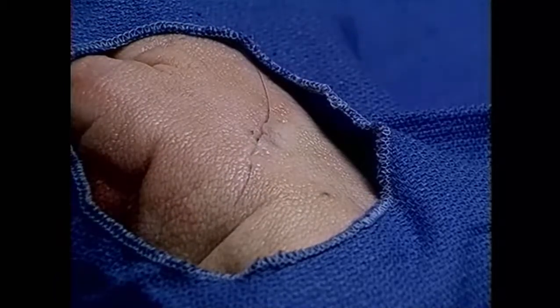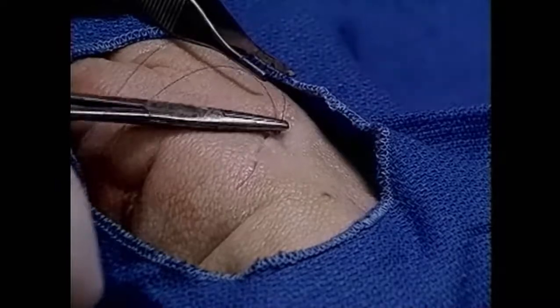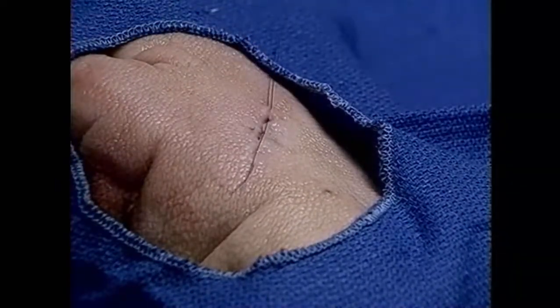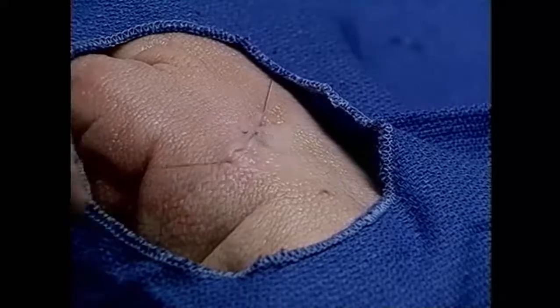Now, as you exit, you do the same as when you started — you come out distal to the wound, resulting in a very fine scar that you can actually pull the suture material through.